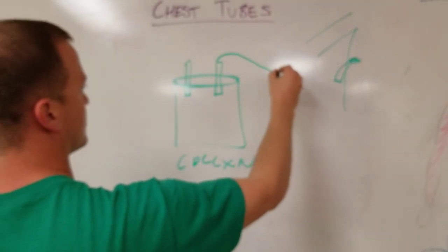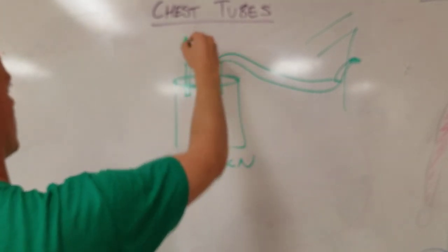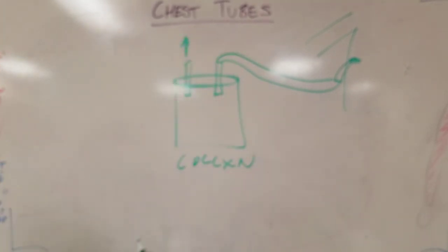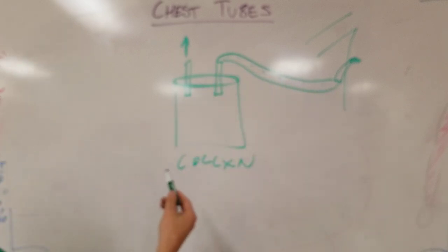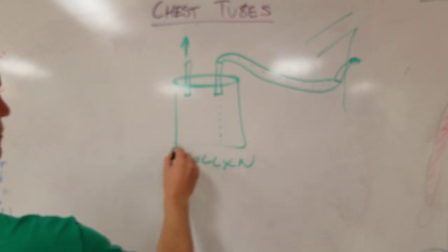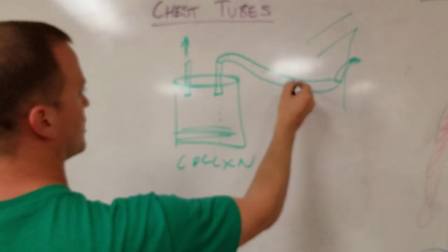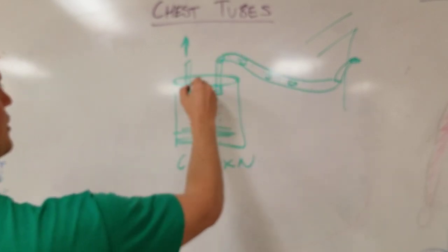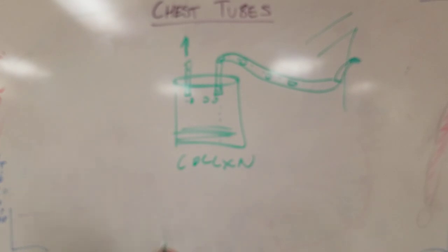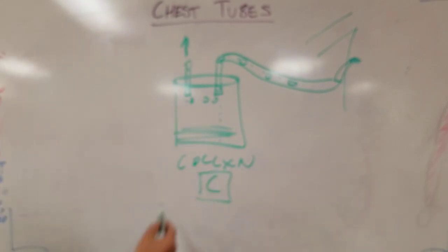If I take this and I hook it up to the chest tube, okay, and I'm causing suction here, what's gonna happen? The liquids that come out of this patient's chest, like blood or liquid or chyle or whatever, are gonna drip down because of gravity, they're gonna start to accumulate here. Whereas the gas that comes through from a pneumothorax is just gonna track right along, and it's gonna follow the suction out, okay? The only purpose of this, I'm gonna call it the collection chamber, is to accumulate fluid.